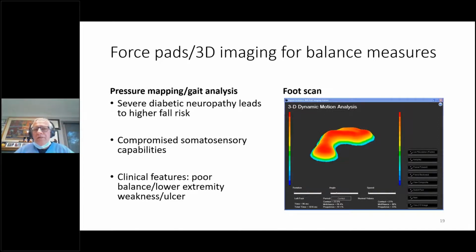Another important population that I see that can handcuff us at times in terms of treatment interventions will be our neuropathy patients, our diabetic neuropathy, all the different neuropathy subtypes that are out there. And so we really felt that our neuropathy patients could benefit from improved perfusion that we were seeing with this biosensor technology. So we began testing them using various instruments, including pressure analysis.